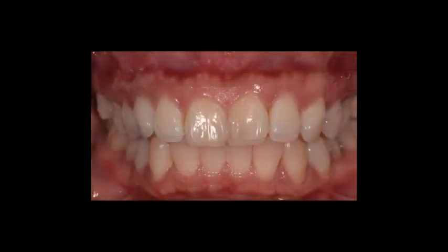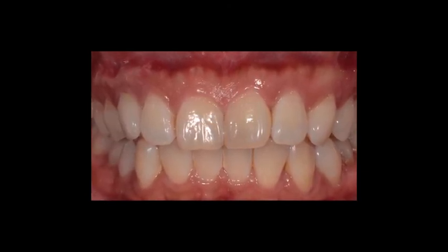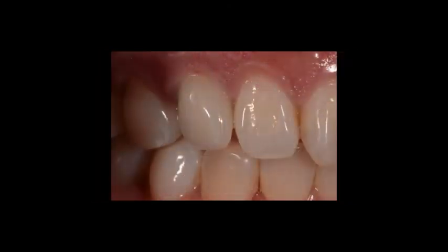This was a cemented restoration. This time it was fabricated by Drs. Puri, Fleming, and Scramstead. So an Emax restoration bonded to an Emax hybrid abutment. You can see here the close-up on the day of the seat. Very nice shading, and this is a cemented restoration on, again, an Emax hybrid abutment, all done in-house with the CEREC technology. Obviously, we had to do a cemented restoration in this case just because the screw access hole, as was visible previously, was emerging through the incisal edge.